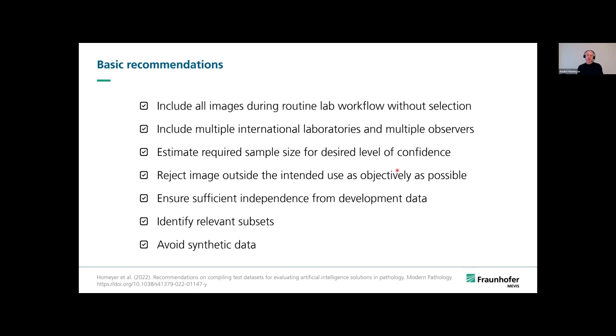images outside the intended use, unsuitable images, should not be included in test data sets because they would heavily distort performance measurements. But since the manual selection of unsuitable images is subjective, it may be useful to use automated quality control software solutions, and hopefully they will become more and more robust and better and generic in the future.